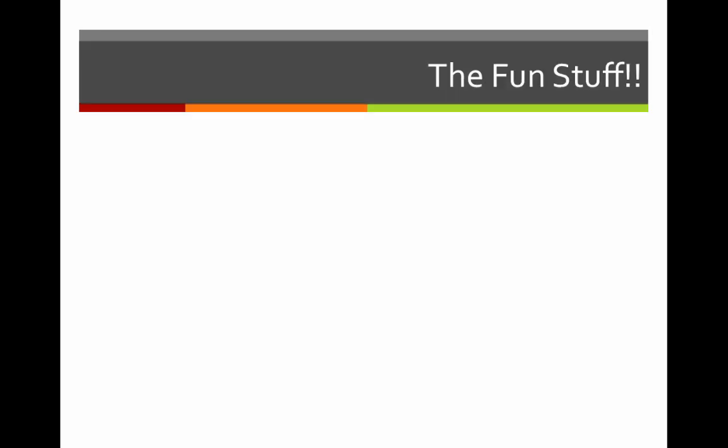Now we're not just looking to impress our cardiologists and EP doctors, but potentially save some lives and drastically improve patient outcomes. So what we're going to talk about today, a number of things. We're just going to gloss over a lot of these. You can certainly read into any one of these topics ad nauseum, but we're just going to talk about it real quickly. First off, trifascicular blocks.